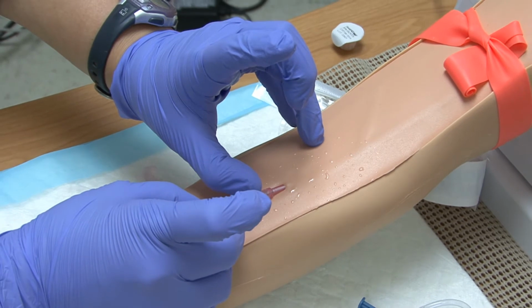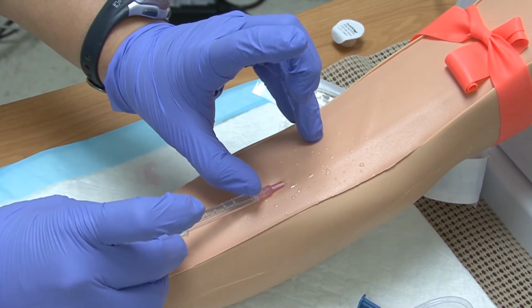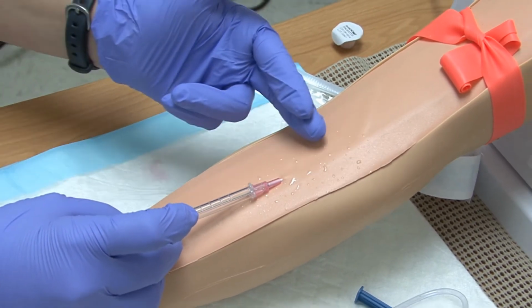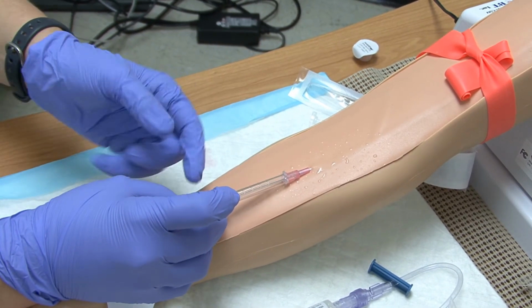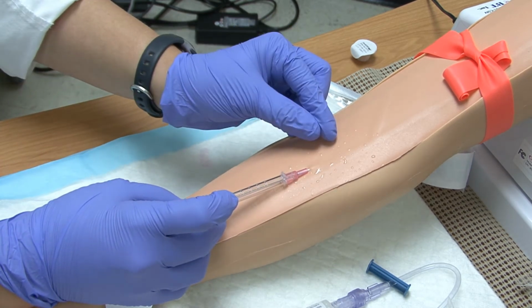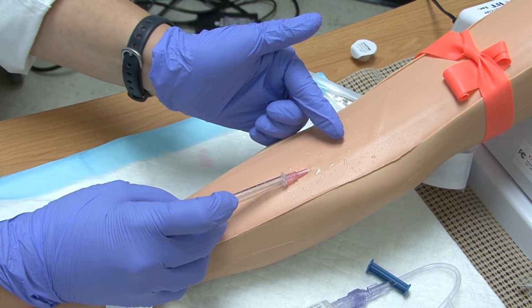Meanwhile, this is staying still. I continue to hold this while I pull back on this until it snaps. At this point, I have inserted the plastic catheter into the patient's vein, and I have pulled the needle back out. Please make sure that you do not pull the needle out before you have the catheter up to the hub. The needle is what needs to guide the catheter into the patient's vein.